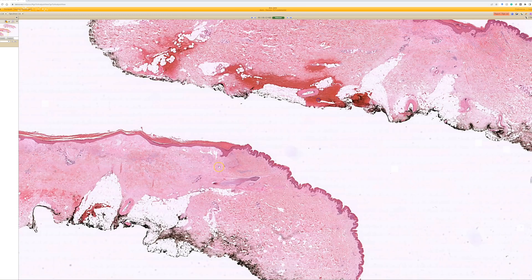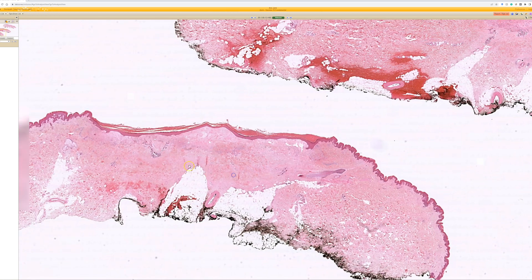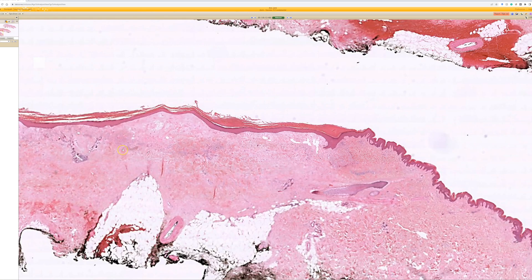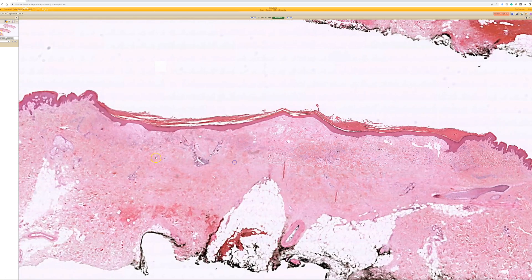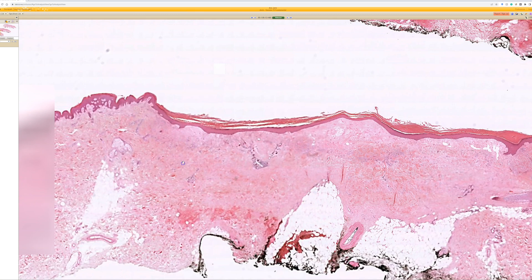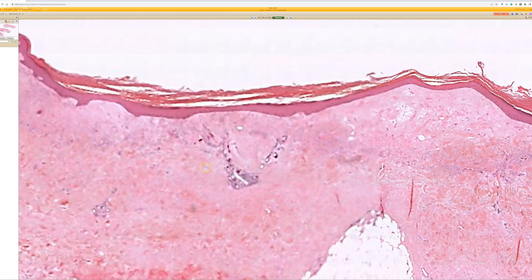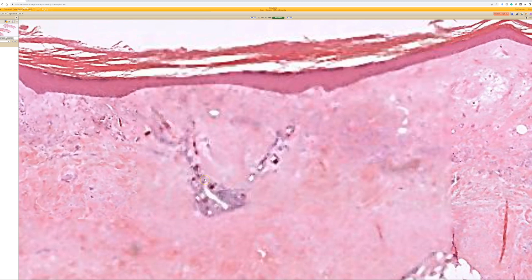That's a biopsy site change - we can see it in three areas. We'll zoom in over here and see the scar from a biopsy, and then we get a little bonus finding here.